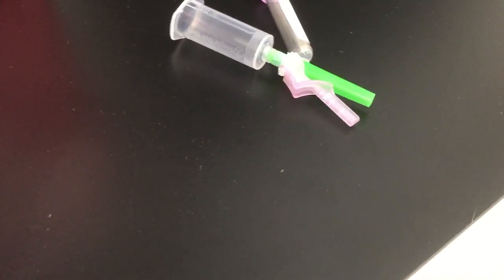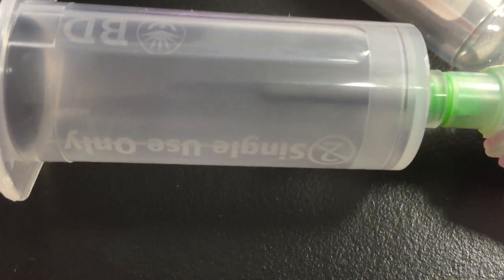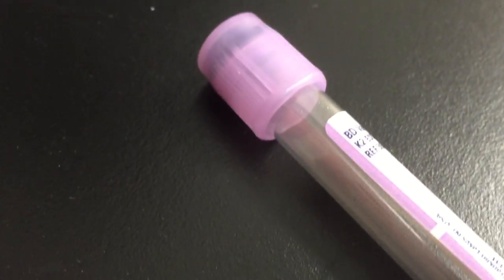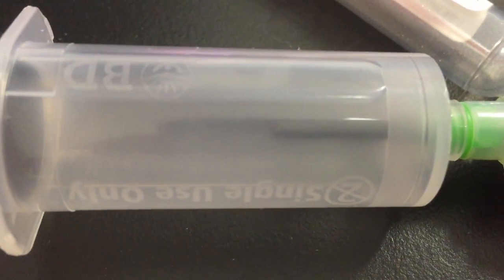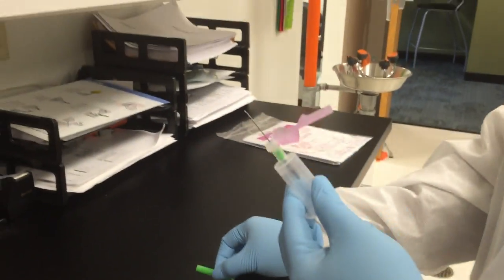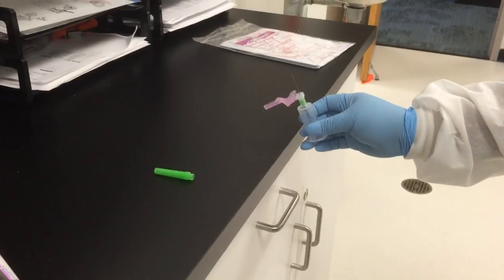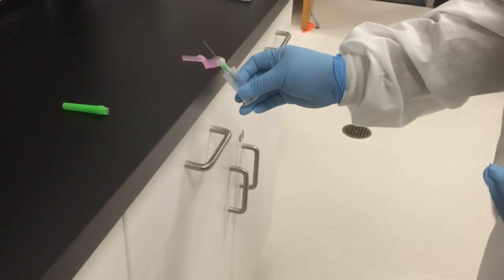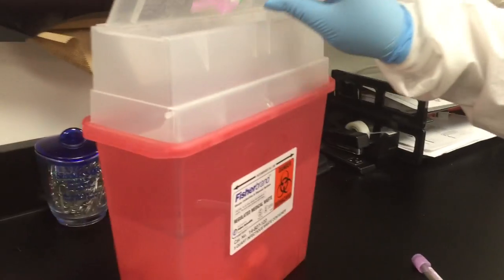This one is already assembled — we have the hub attached to the needle. Inside this needle, we have the needle that actually pierces the tubes. It has a safety device over it so that you don't prick yourself when assembling it. We're going to pull our safety back, take the cap off the needle, and inspect it. After we perform our venipuncture, we immediately engage our safety device and then immediately put it in the sharps container.